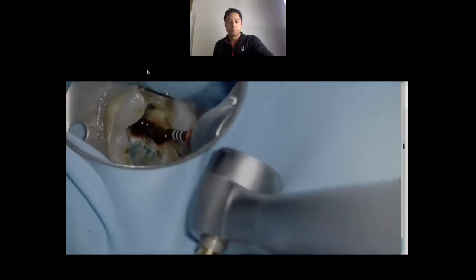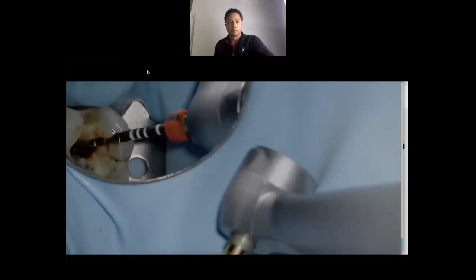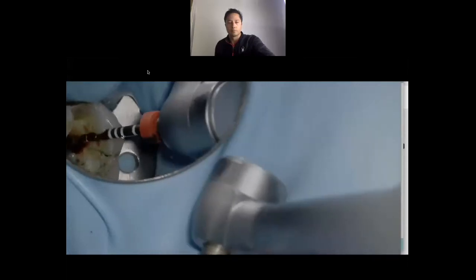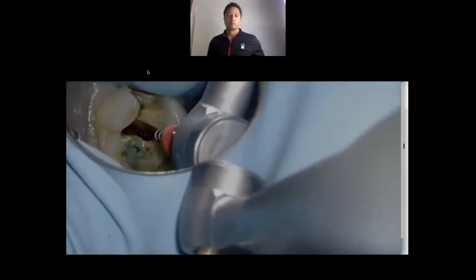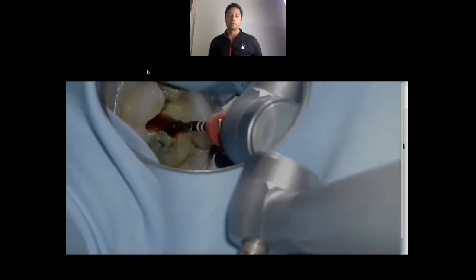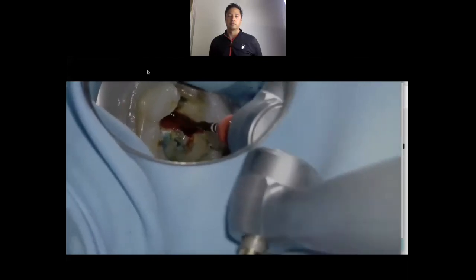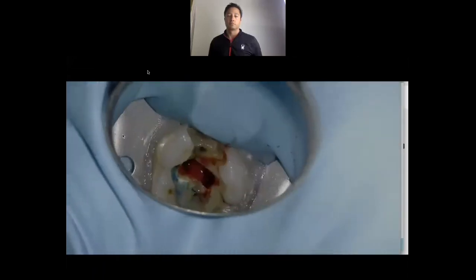I'm going to use my Wave and Gold file. You can see how I've angled my mirror just a subtle angle — I'm looking, going to open up my orifices just to the cutting flutes. Most teeth are roughly 19 to 21 millimeters long. We're going to open the coronal two-thirds of all these canals — roughly 14 to 16 millimeters. I'm using the existing hemorrhage and pulp tissue just as lubricants. It's a really quick way to open up those cases and get some irrigant down there. I'm using light brushing techniques, and the hemorrhage in the pulp chamber actually helps empty the debris from the flutes.